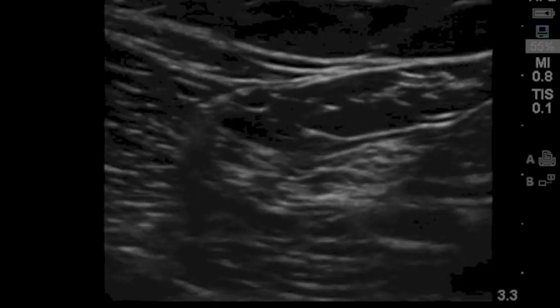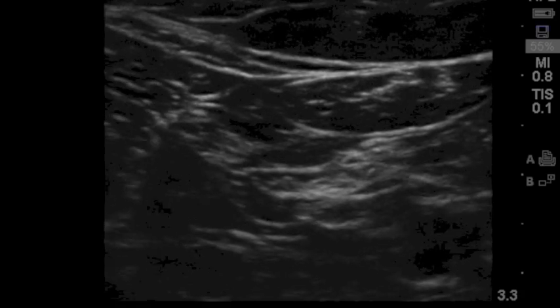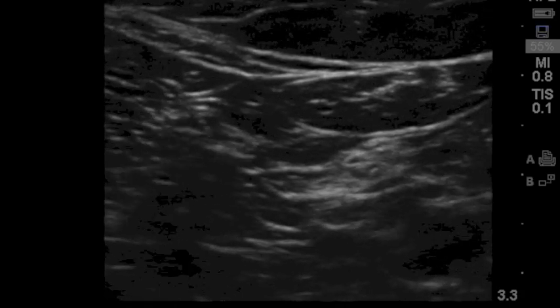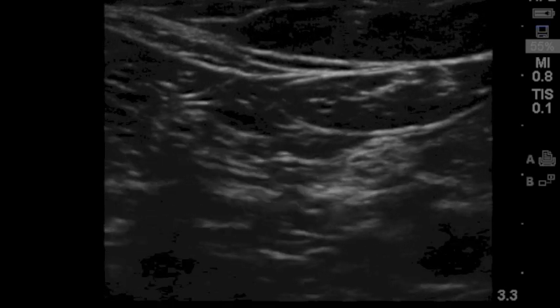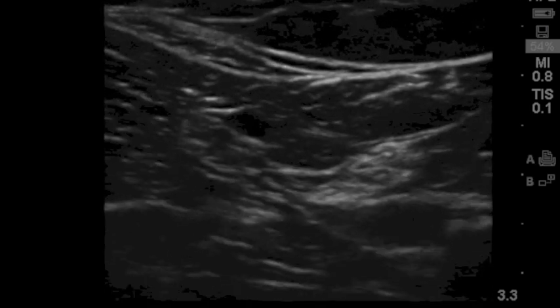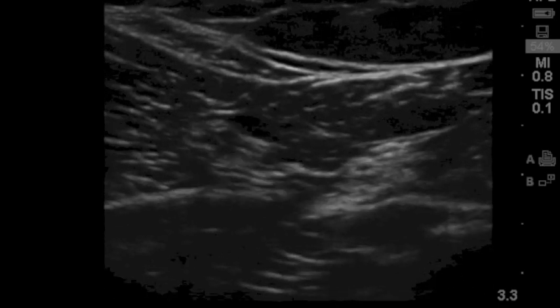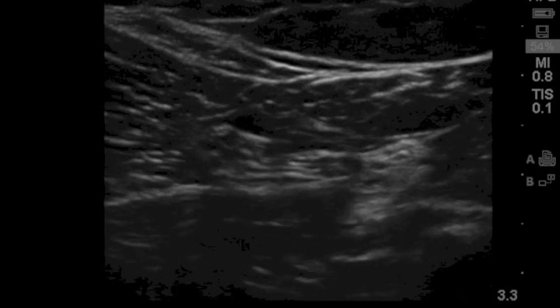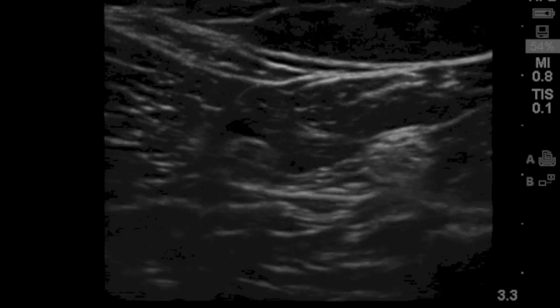Once I've acquired the view that I want, I'm going to be placing the needle just as I showed in the last example. You're going to see the needle coming from the left side of the screen moving toward the nerve. My target is actually to get just underneath the nerve as you see it there now. That's the ideal place that I like to start my injection from. You see me making adjustments as I head to the nerve so that the needle can sit right underneath the nerve where I have it placed right now.